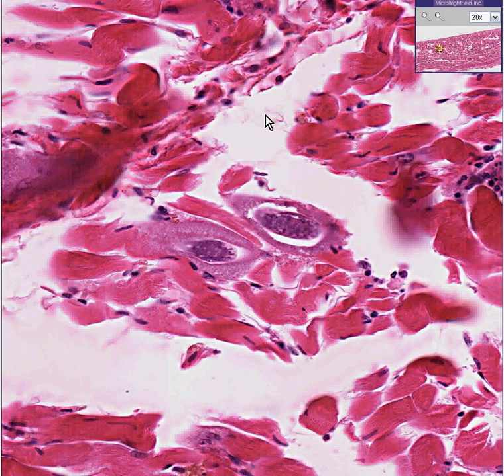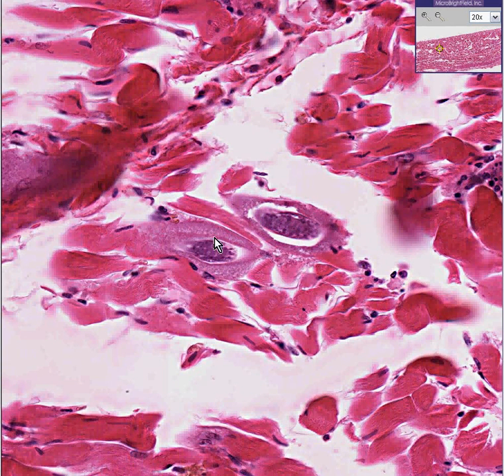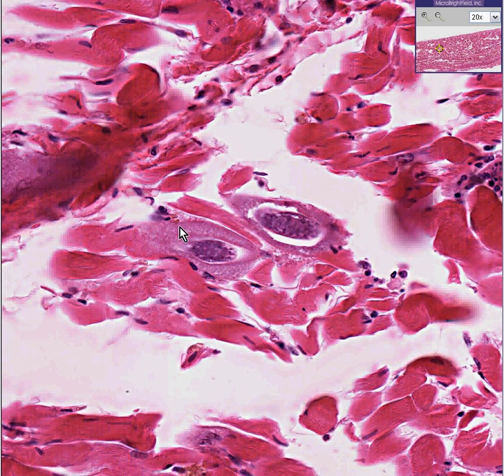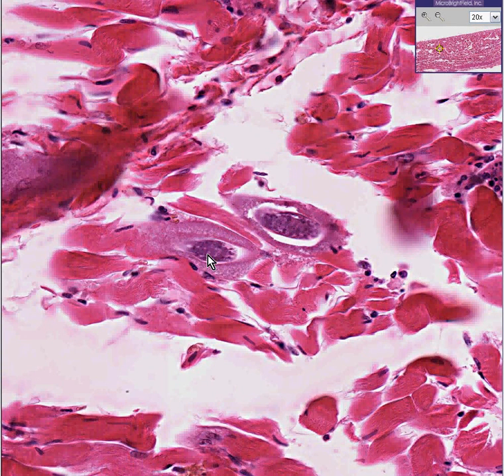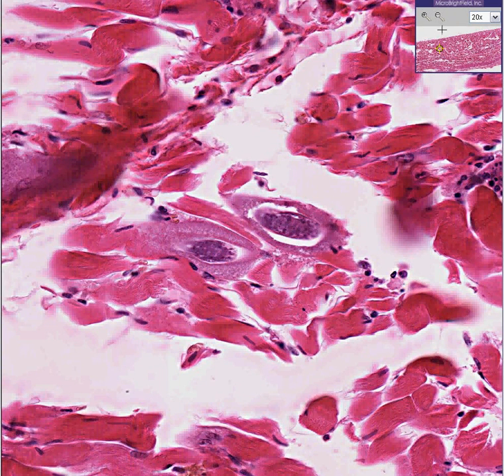It doesn't look like human tissue — nothing ever seen normally in the human body. It looks to be a little darker or more calcified on the inside, with a little bit of granularity. Comparing to the last case of trichinosis, those may have been older cysts because they were more hyalinized and had less detail on the inside. But you could go all over this slide and find a whole bunch of them, because there are a whole bunch of them.